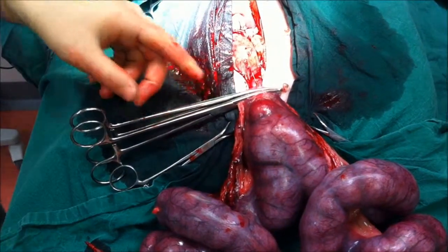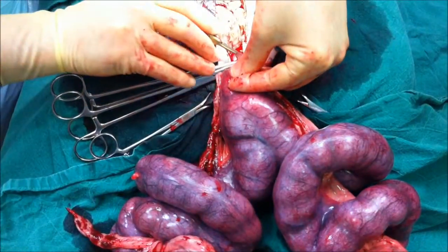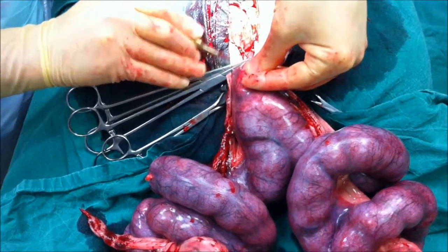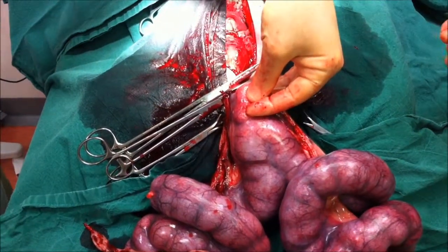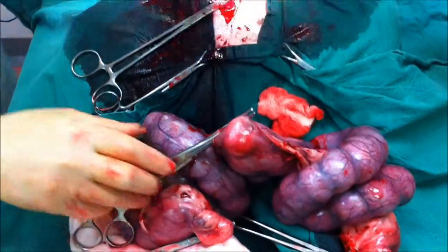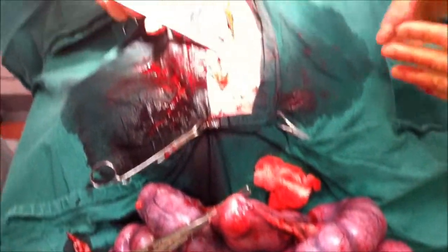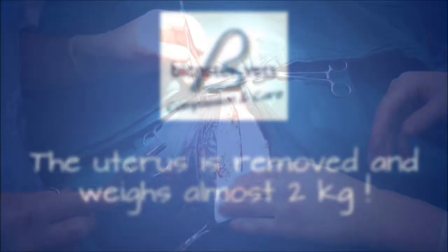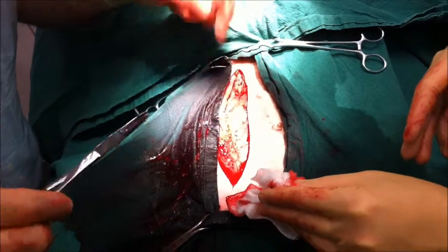We've now tied off the cervix and we're just going to cut through this final attachment of the uterus. And that's the end of the hysterectomy part. Now we've just got to tidy this up and stitch her up. We're stitching up the muscle layer here now, working our way out.